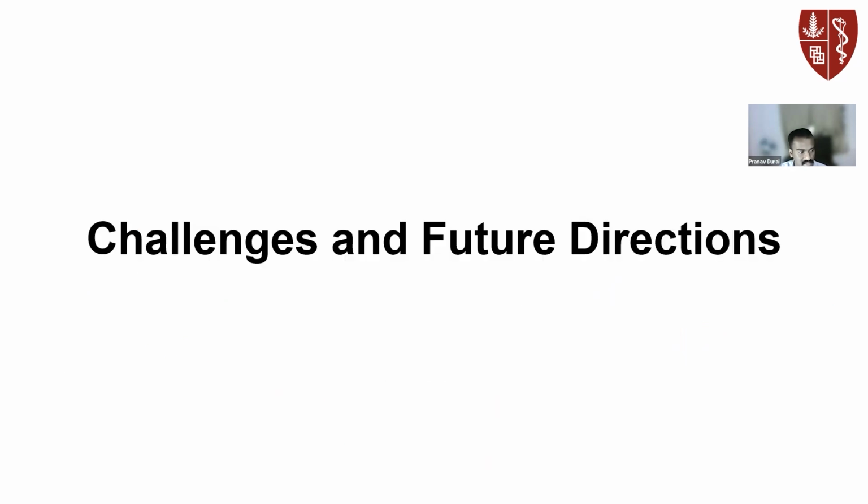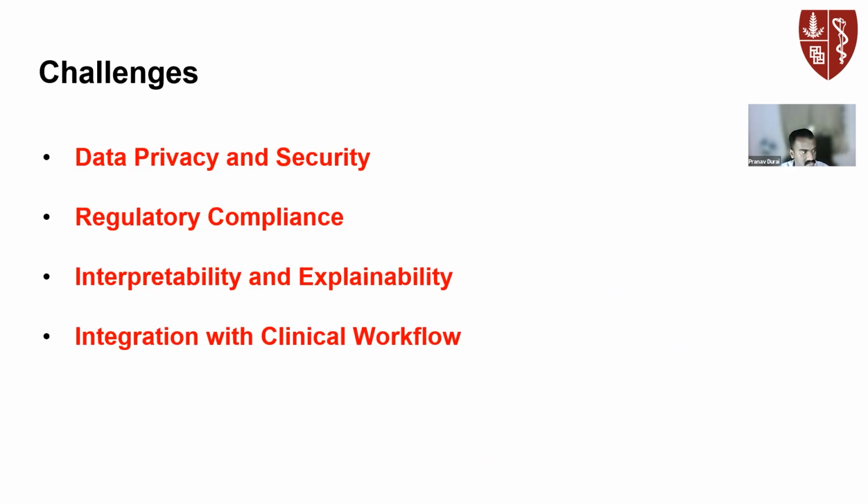So, what are the challenges and future directions? Right. So, the challenges that I see is that the first thing is patient data is private, right? So, you need to make sure that you have good protection over all of these medical data sets, right? And you also have some kind of regulatory compliance, right? Different parts of the world have different governments with different regulatory rules and compliances, so you need to follow that, right? The third thing is also interpretability and explainability, right?